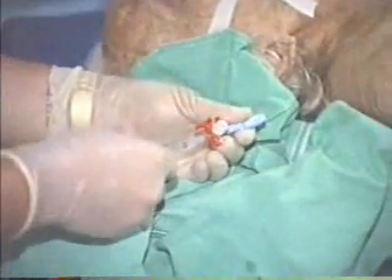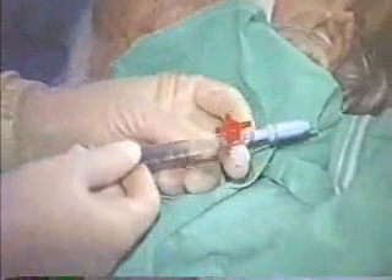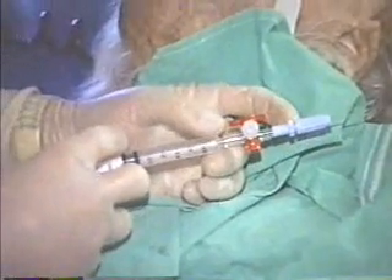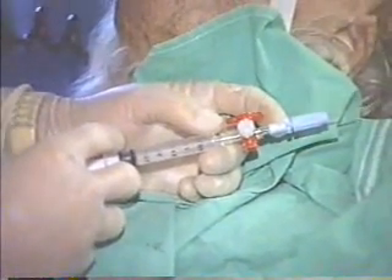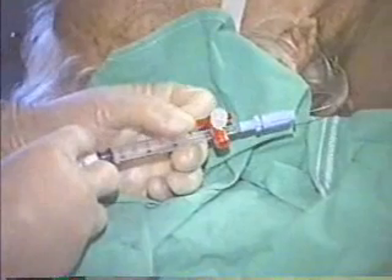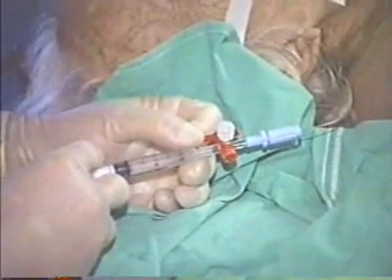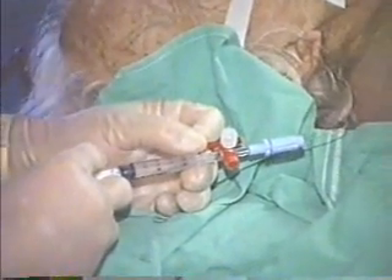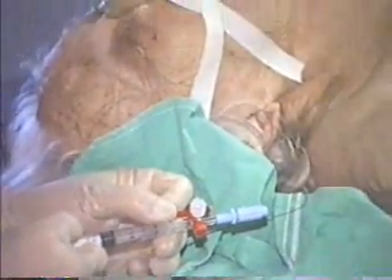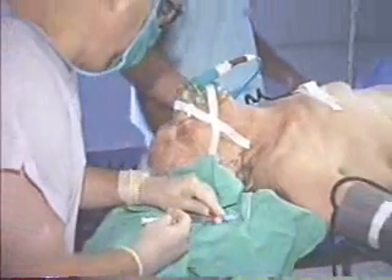We are going to attach a three-way stopcock and start the first dose. Now we are injecting 7.5 milligrams per cc. The blood pressure is 160 over about 80. The first dose is going in — 7.5 milligrams. We don't worry about repositioning because we are dealing with an isobaric solution. Position has no importance here — that's the advantage of this approach. Let's close our stopcock.